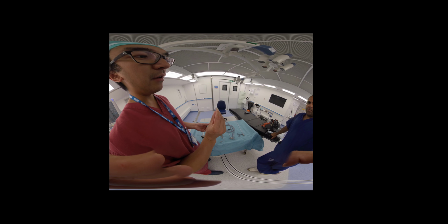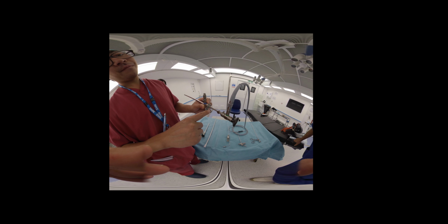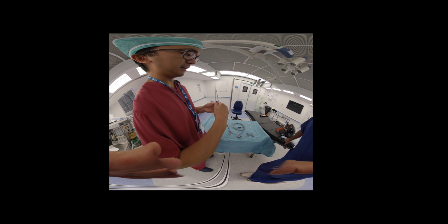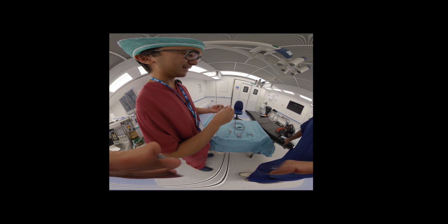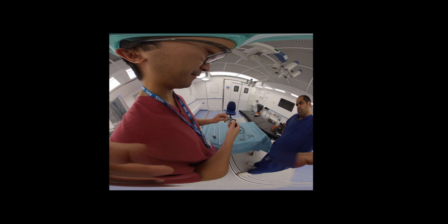There's a 0 on the adapter there, and that lines up with a 0 on the side port there as well. Okay, so you just push that on. There you go, and that will click into place. There's a rubber bung on here. This comes in a separate small pack, but it's all in the same set. Essentially what that does is you put that over the port, and that will minimize any loss of anesthetic gases back out through the side port. And you can insert either a suction catheter through here, or even finer flexible endoscopic instruments, which are also available in this set.